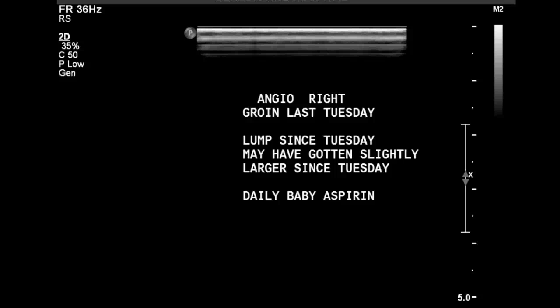For this exam, the sonographer gives a brief history on the screen. This person presents with a lump in the groin area that they've had since their angio last Tuesday. So immediately you should be thinking PSA, or pseudoaneurysm, especially since it says it may have gotten slightly larger since last Tuesday.